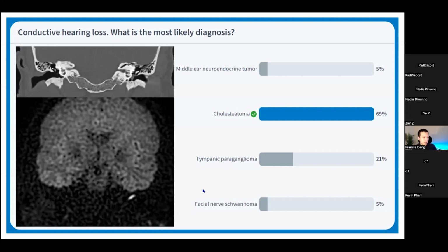Congenital, yes. Somebody asked whether this is congenital. This is an unusual location for acquired cholesteatomas, and so it's possible that this is a congenital cholesteatoma. Acquired cholesteatomas typically occur a little bit more superiorly in Prussak's space. And this is larger and more inferior. And apparently the tympanic membrane was intact on physical exam here. So this was thought to be a congenital cholesteatoma, yes.